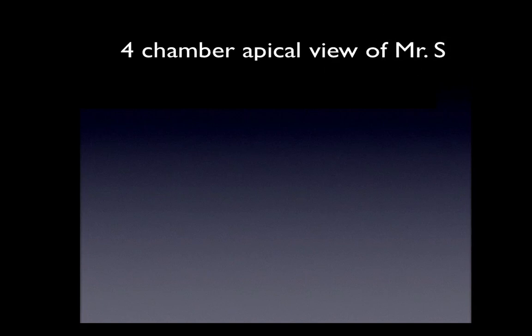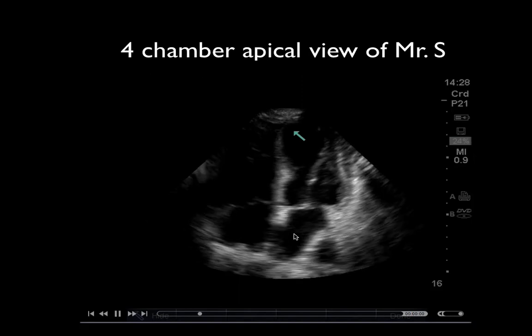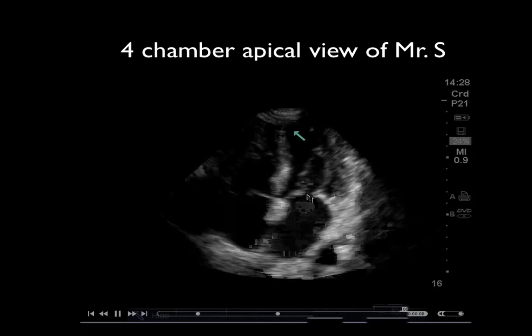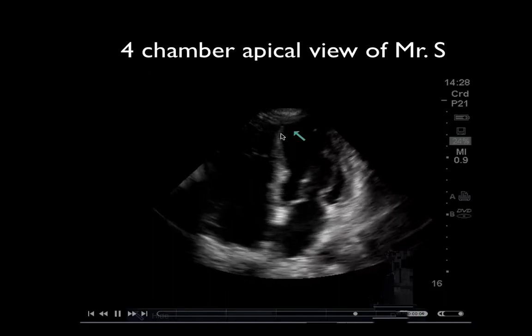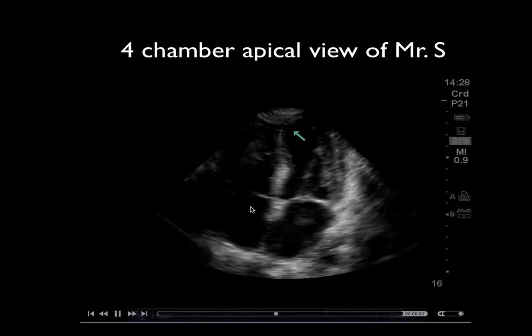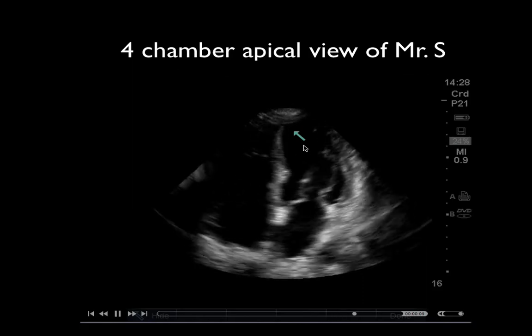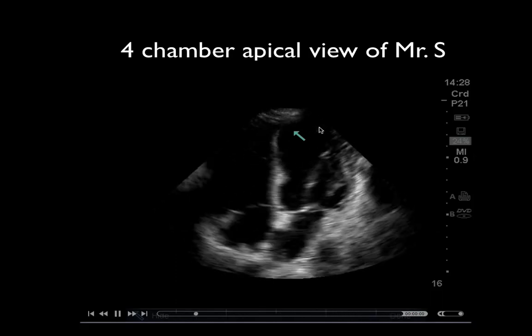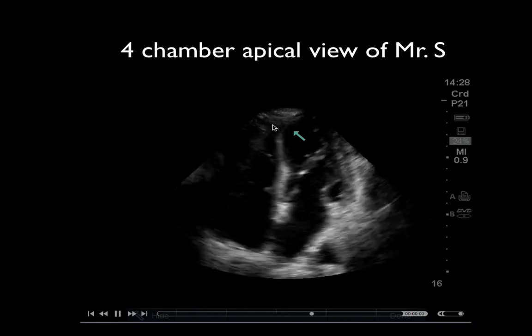Now let's look at another image. This is the actual four-chamber apical view of Mr. S. Left atrium going to the left ventricle. The mitral valve can be seen opening, with the valve tethered at both leaflets to the chordae tendineae going to the papillary muscle. The septum is over here, and this is the right side of the heart — right atrium, tricuspid valves opening and closing, right ventricle. The arrow points to the apex of the heart. The apex should be made up primarily of the left ventricular apex, and the right ventricle should be a small sliver, but that's not the case here.